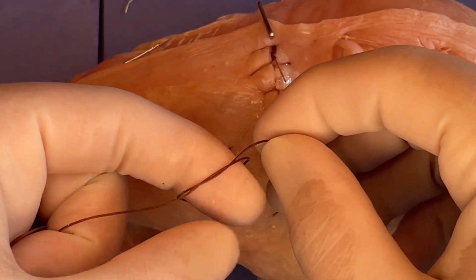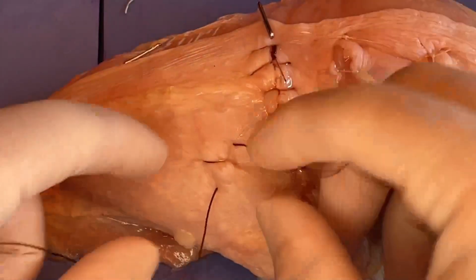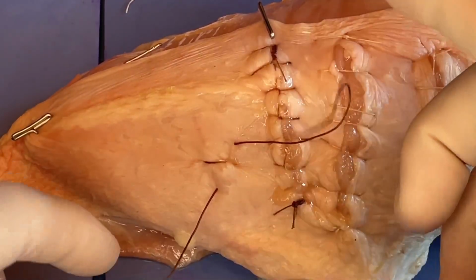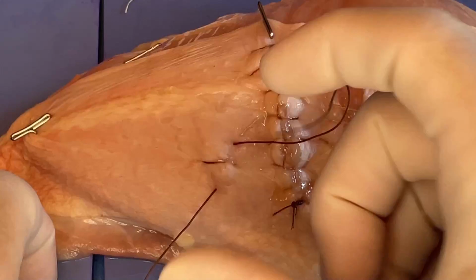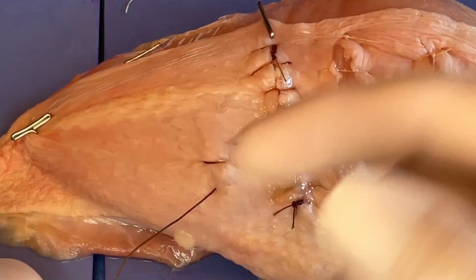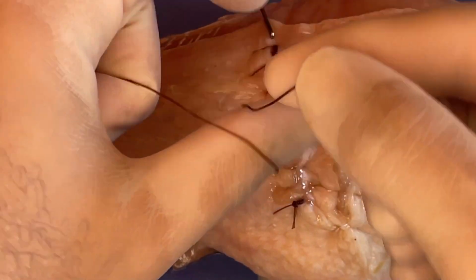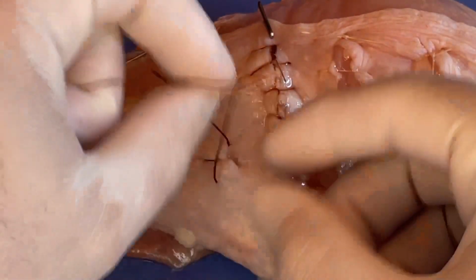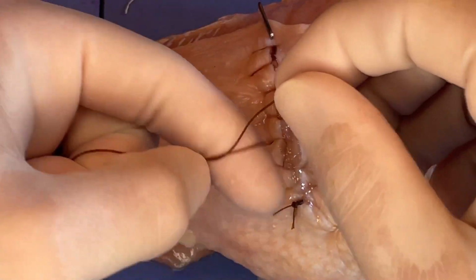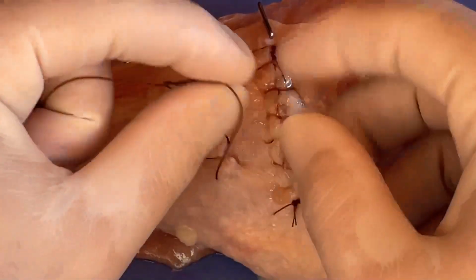And figure of 8 sutures are one area where I do tend to do surgeon's knots, because oftentimes you've got a pretty big area here that you're trying to compress, and we really want that first throw to remain tight to keep that tissue under tension while we do our second throw, completing our first square knot. So a surgeon's knot would look like we make our loop, we go through just like we normally would, but then instead of pulling this tight, we just go and loop again. So again, over the thumb, pull that loop through.